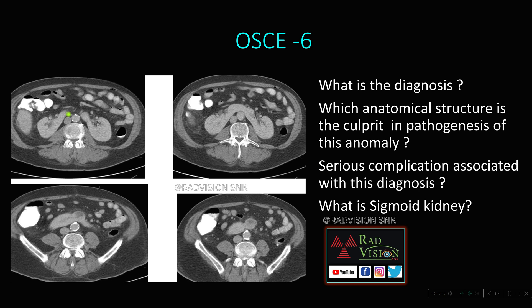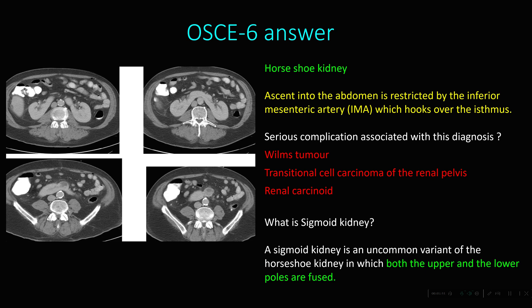Next, OSCE 6. Here you can see the inferior and middle poles of both kidneys are fused — this is a horseshoe kidney. There is also a heterogeneously enhancing mass arising from the pelvis of these fused kidneys, indicating malignancy. The ascent of the horseshoe kidney into the abdomen is restricted by the inferior mesenteric artery, which hooks over the isthmus and stops renal ascent. The serious complications of horseshoe kidney include Wilms' tumor, transitional cell carcinoma of the renal pelvis, and renal carcinoid. This case turned out to be a transitional cell carcinoma of the renal pelvis.